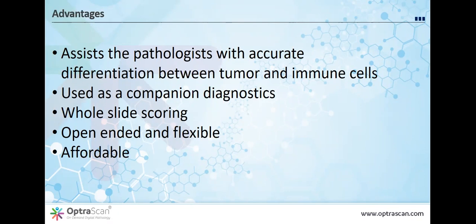The instrument and the algorithm is actually calibrated against pathologists. And the paper that you showed using the Yale cases from David Rimm really used 3 pathologists who were experienced, actually 4 pathologists who looked at the slides, but 3 who were very experienced in relationship to PD-L1 scoring, producing consensus scores.